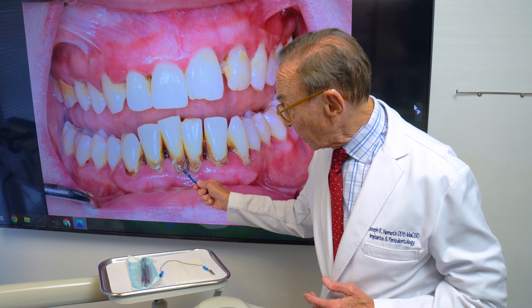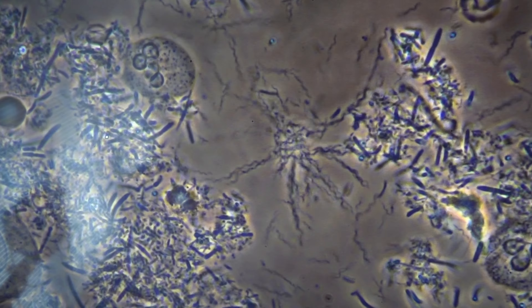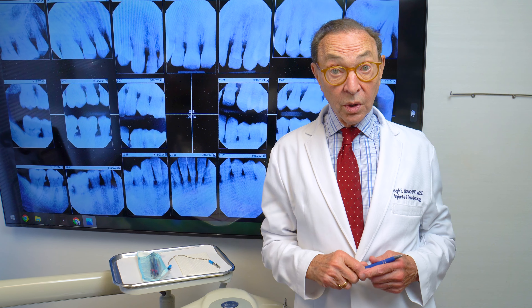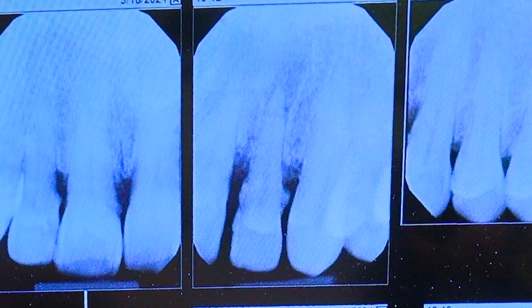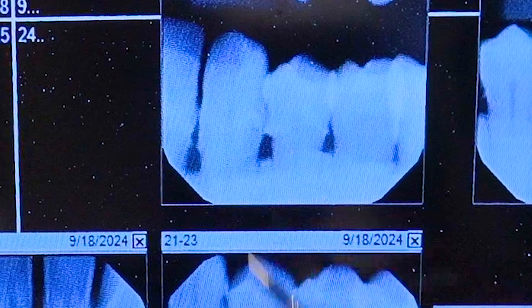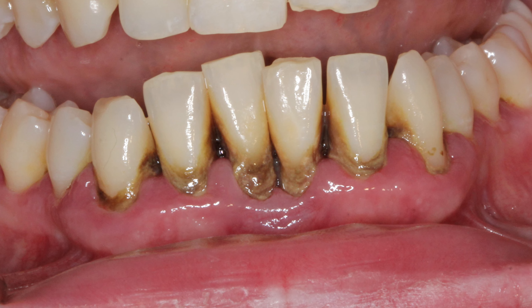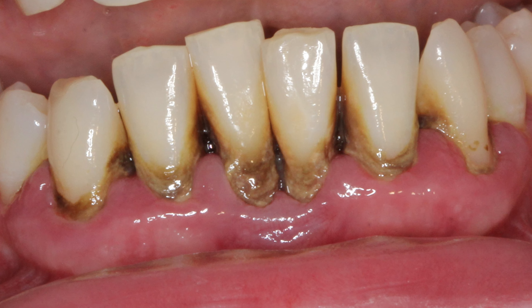You can see tartar here, here, and here. We took a slide and the slide showed a lot of parasites and a lot of organisms that were causing the disease. On the x-ray, you can see these spikes on the sides of the teeth — these spikes are actually tartar or calculus that has never been removed. It's irritating the gum tissue, trapping bacteria, and trapping parasites.